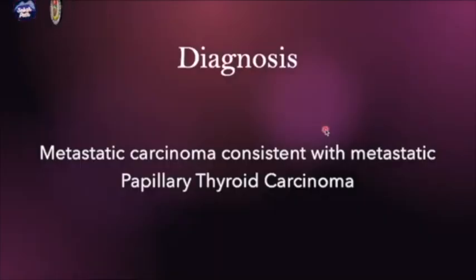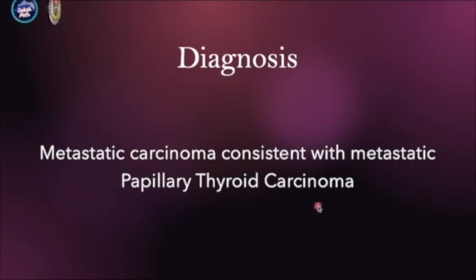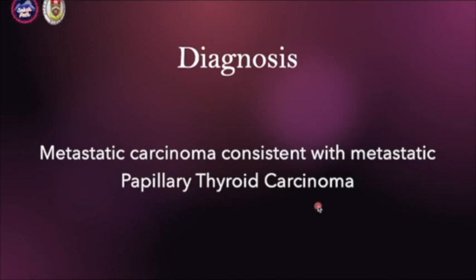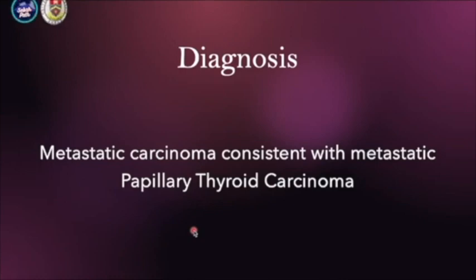This is what we call intranuclear cytoplasmic inclusion. Some pathologists call it nuclear pseudo-inclusion because it's actually cytoplasmic inclusion going into the nucleus, not a true inclusion. So in this case, it is a metastatic carcinoma consistent with metastatic papillary thyroid carcinoma. For papillary thyroid carcinoma, it usually has three characteristics: changes to the size and architecture, changes in the membrane, and changes in the chromatin. Usually two out of three changes confirm the diagnosis.